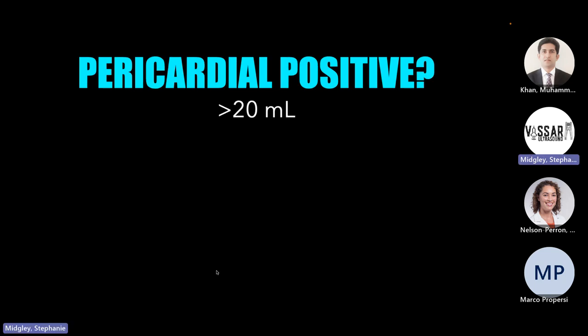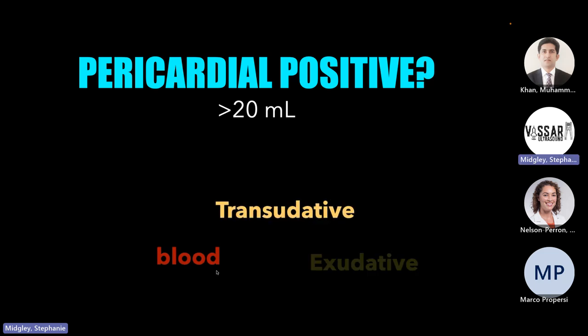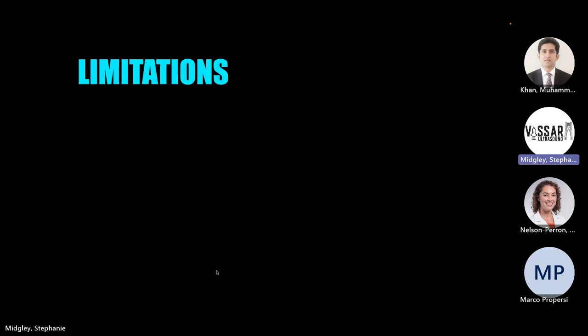For pericardial effusions, again, a small amount is going to cause a positive. Blood can do it, transudative, exudative, right? Malignancy, infection. There was a great case that we had where a patient who had strep pneumo bacteremia came in in tamponade from their exudative pericardial effusion that was strep. It was gross. And it was cool because we had a pre-ultrasound when she first presented in the ED, got discharged, and then came back like 3 days later, and the repeat ultrasound showed the pericardial effusion.